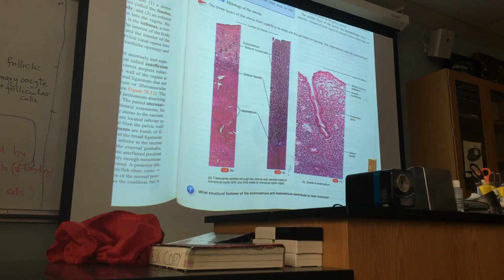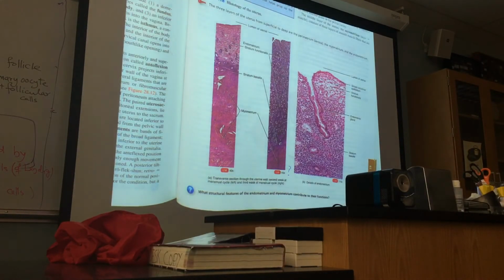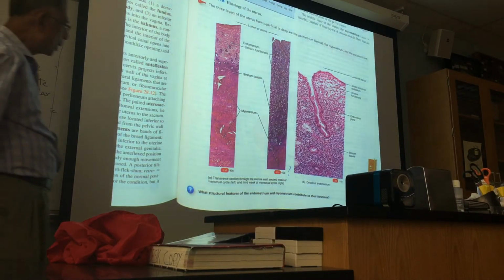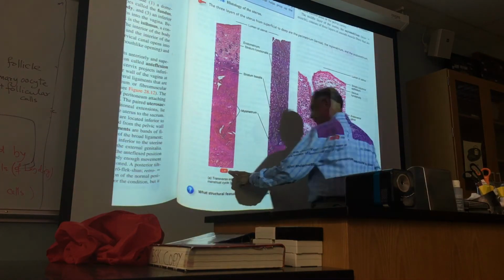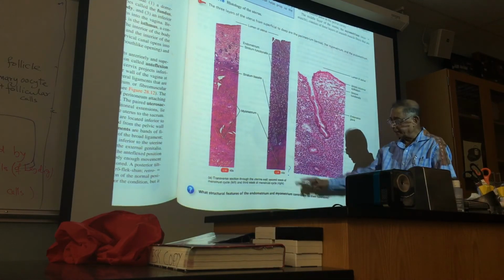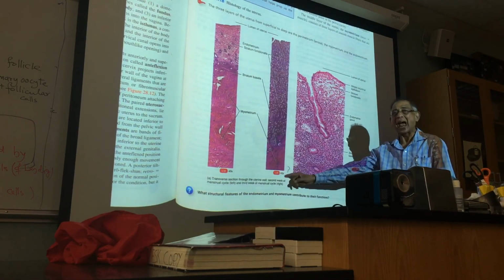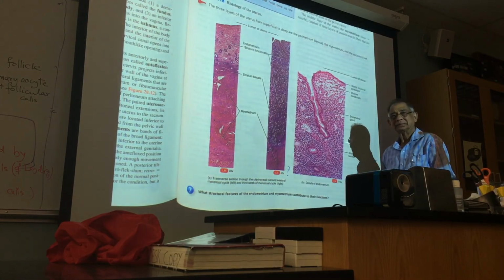Yes. So is there something missing from that? You have a question mark at the bottom. My question mark at the bottom is because there is an error. This is 40 times magnification, here again 40 times. It has to be more. Do you get that? Okay, yeah?